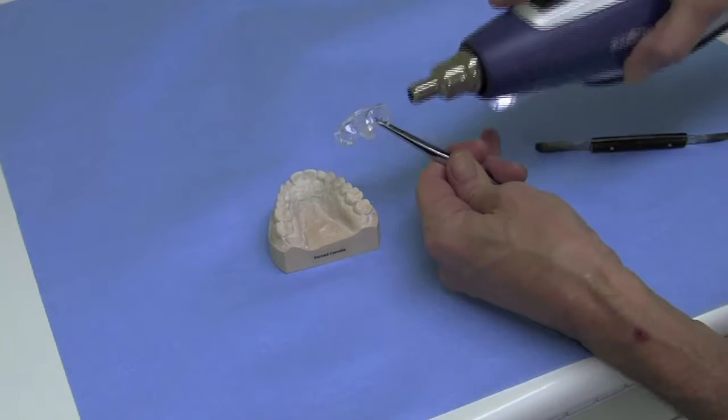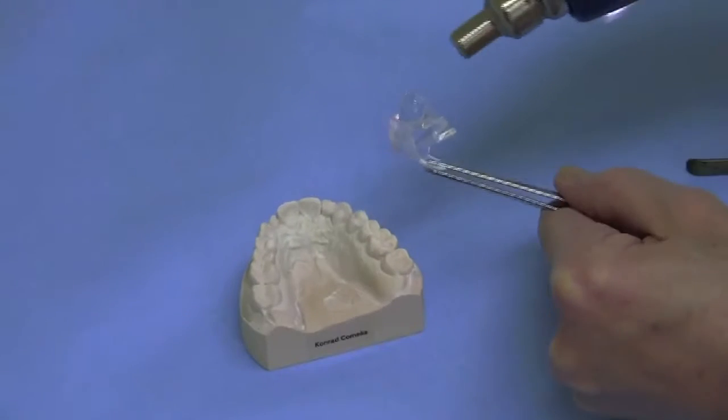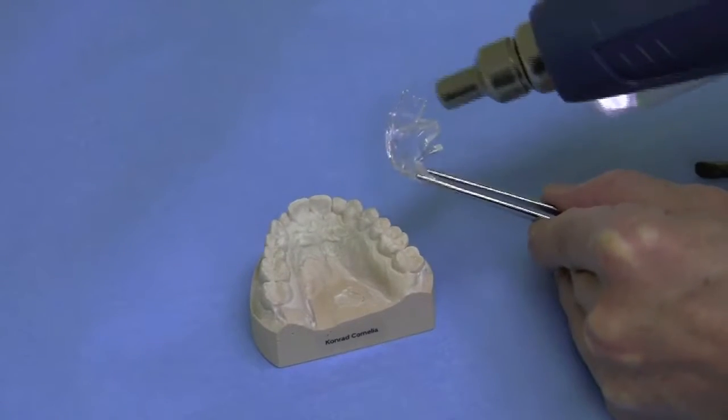If a model is available, or if the clinical situation is difficult, you or your dental technician can adapt the FOS splint on that model.